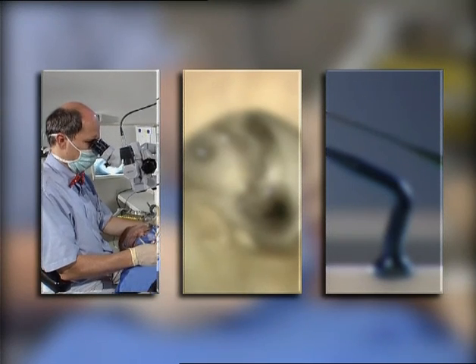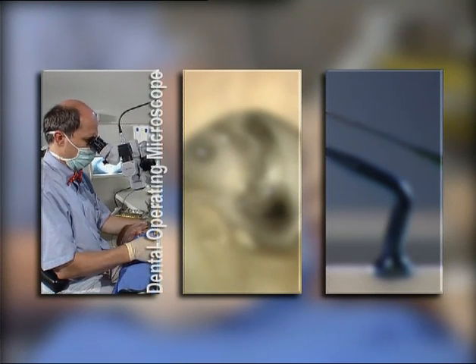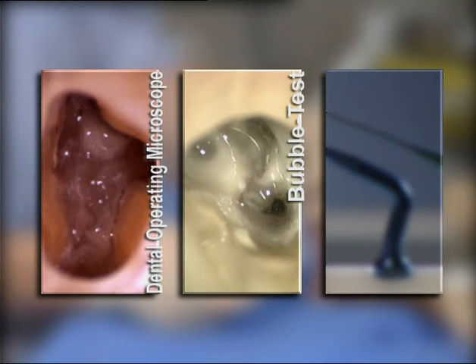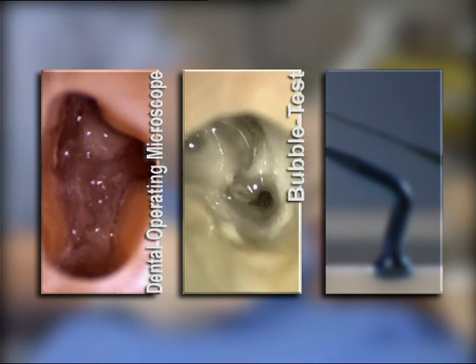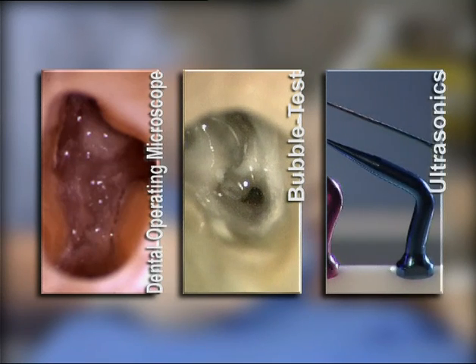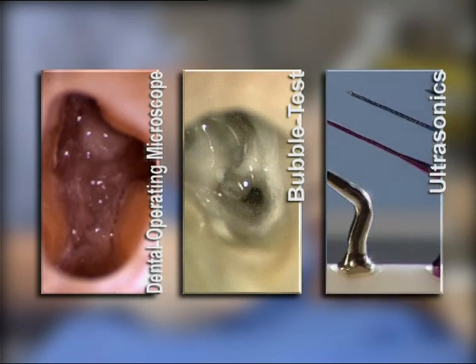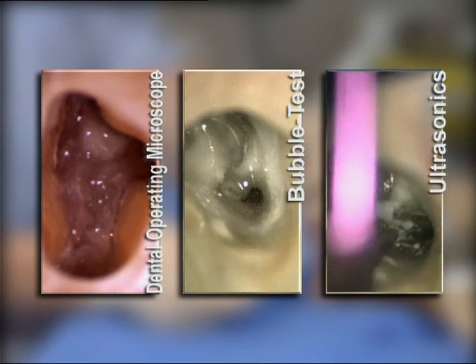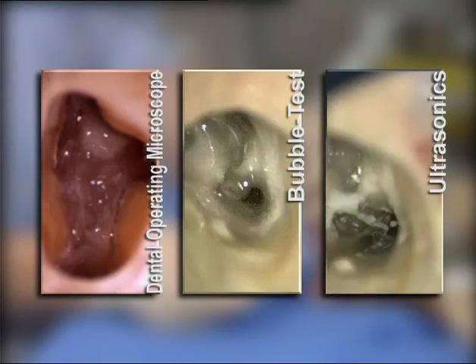The operating microscope to better visualize the anatomic footprints, such as the developmental grooves. They display different color and translucency than the surrounding dentin. The champagne test with sodium hypochlorite: sodium hypochlorite sets off oxygen in contact with pulpal tissue of non-instrumented canals. The use of specifically designed ultrasonic tips. They allow the removal of restricted tooth structure with optimal visual control and very high precision.